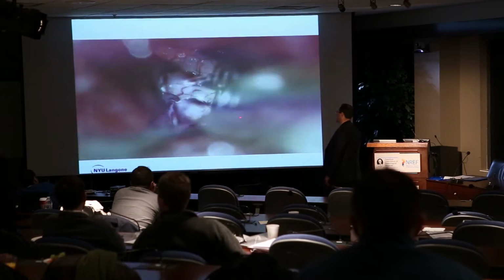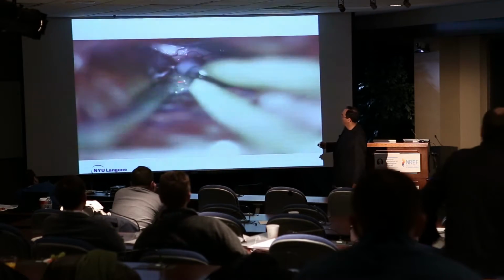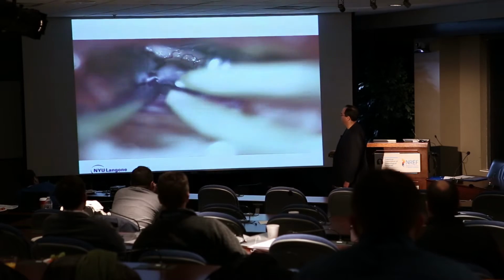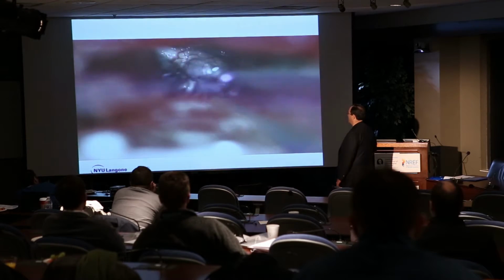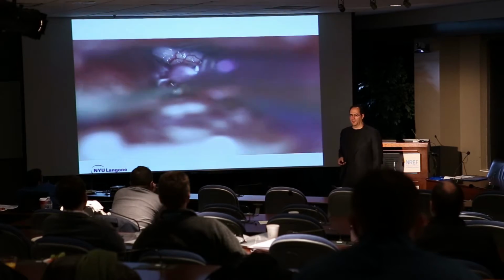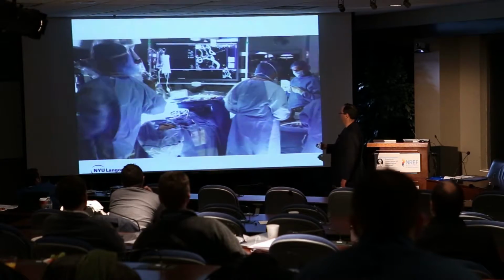When you're learning, I always sit down next to the chief and I take a look around, and I thought that the aneurysm was still filling. And so you'll see how I move the clip a little bit for him. Dr. Tanweer, Omar, here in our room, he clipped his first aneurysm this week, and of course I had to do a little bit of manipulation, but that's how you learn and get it done. So once we clipped the aneurysm, I made a slight adjustment on where my chief had it in.